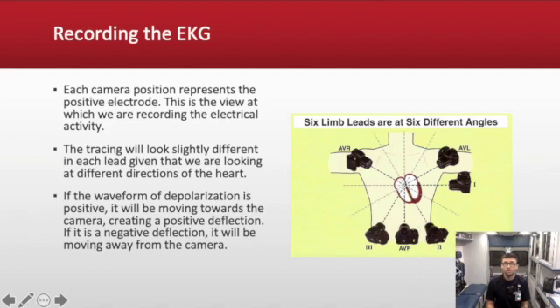On the monitor, this is the one that the EKG actually starts with, lead 2. Lead 3 is the same way. It's going to be looking towards this camera. AVR, looking in a backwards way. This looks at all of our main arteries and veins and parts of the heart that are large on the inferior portion. AVL, same thing, you're looking towards that camera.